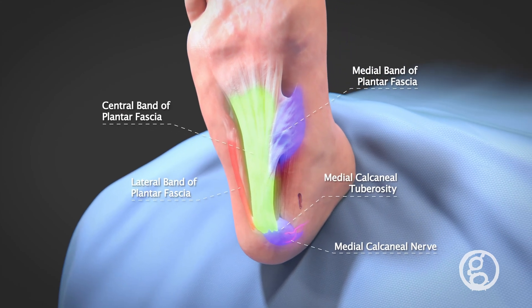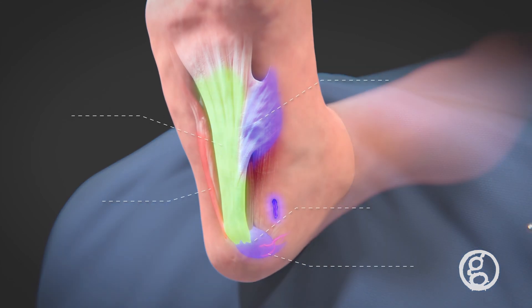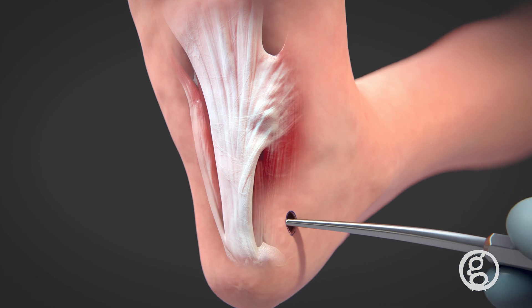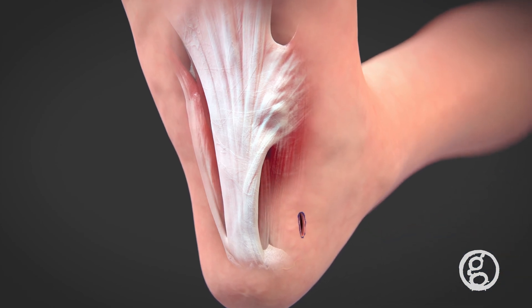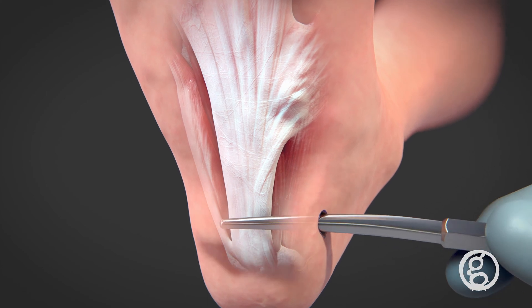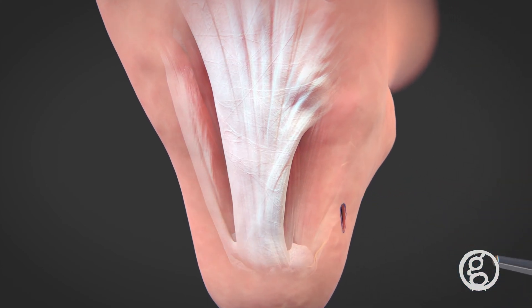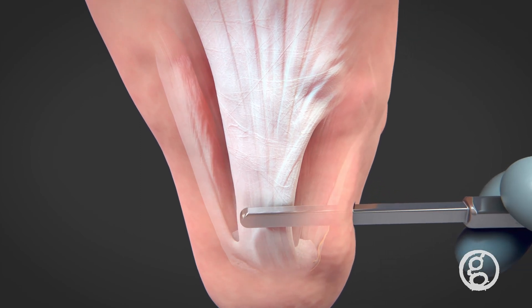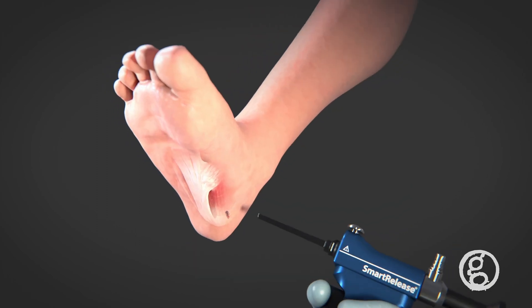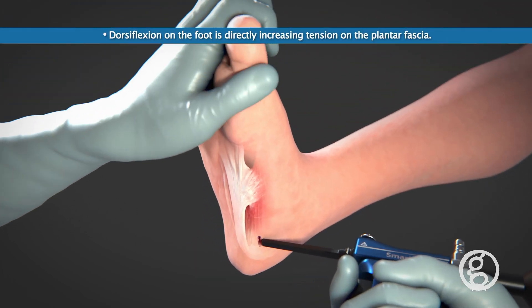The endoscopic procedure with the Smart Release system is easy to learn and simple to use. Once key landmarks have been identified and the incision has been made, a pathway for the device is created by passing the dilators and elevators into the surgical site to separate the skin from the fascia and clear the site for optimal visualization.